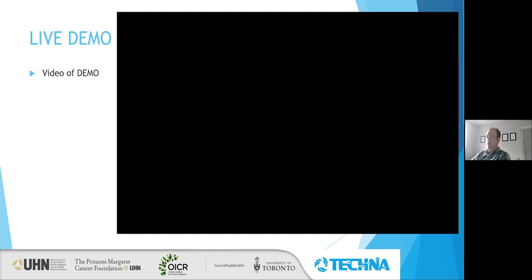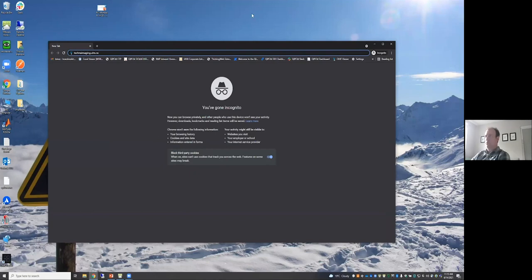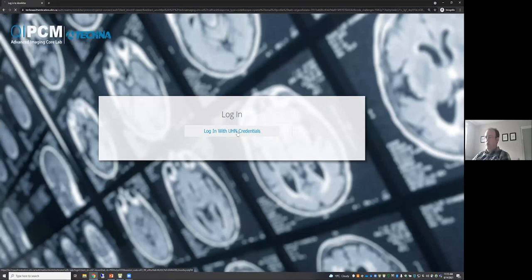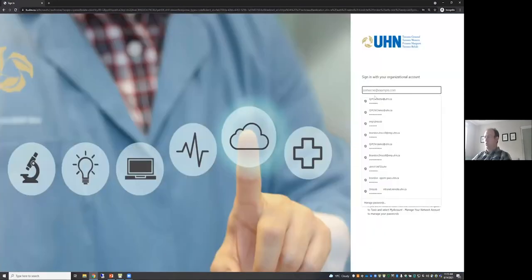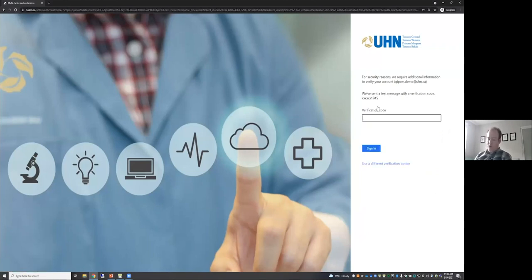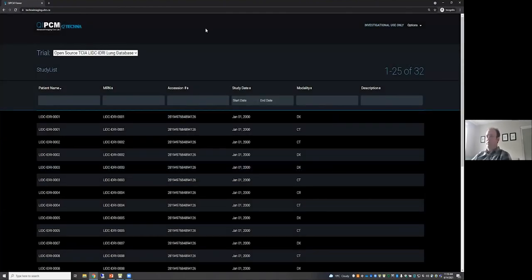Now I'm going to go into the live demo of the web viewer. All we need to do is go to technaimaging.uhn.ca — and just to point out, I'm actually not on VPN right now, just on my home internet, so this is how it would appear to an end user. We'll log in with our UHN credentials. This takes us to the UHN login screen. I'm going to pick one of our demo users, and then text myself a code. And we're in — very similar to a bank login. Our users are pretty happy with that; it's much simpler than our old VM login.